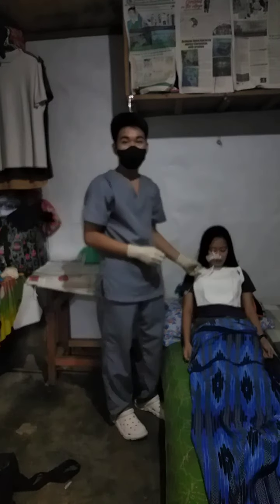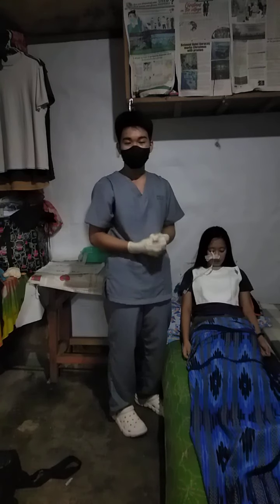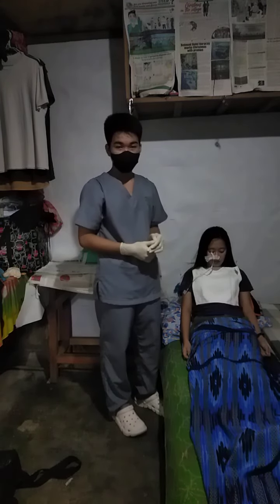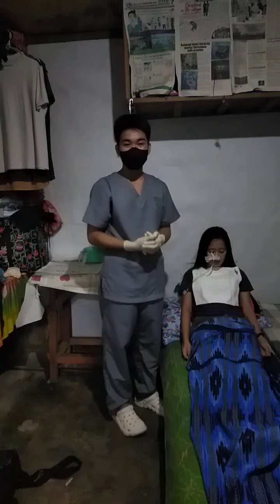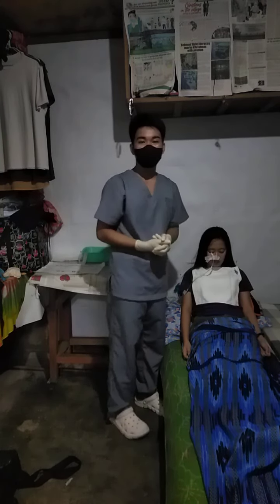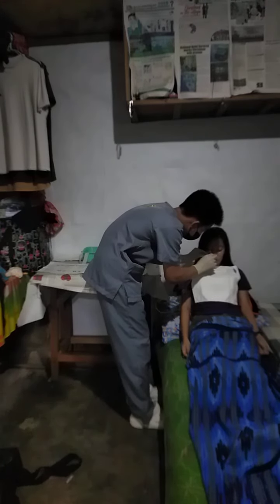Then ask the client to take a deep breath to prevent inadvertent aspiration of gastric contents while the tube is removed. Clamp or kink the tubing securely by folding it over on itself. Then completely withdraw the tube by pulling it out steadily and smoothly. So ma'am, hinga lang po tayo ng malalim. 1, 2, 3. Hinga po.